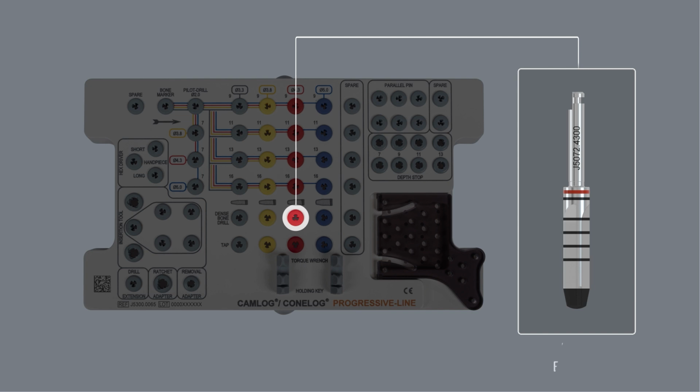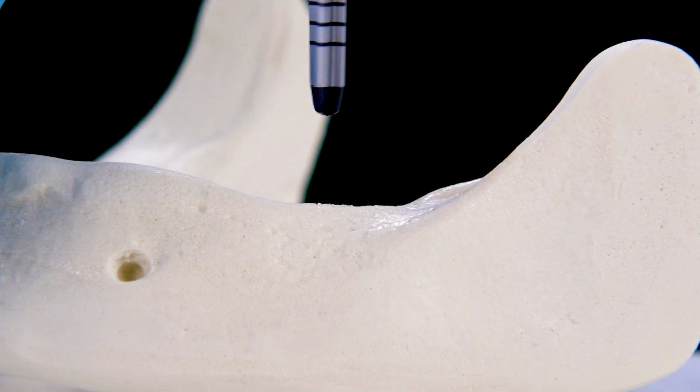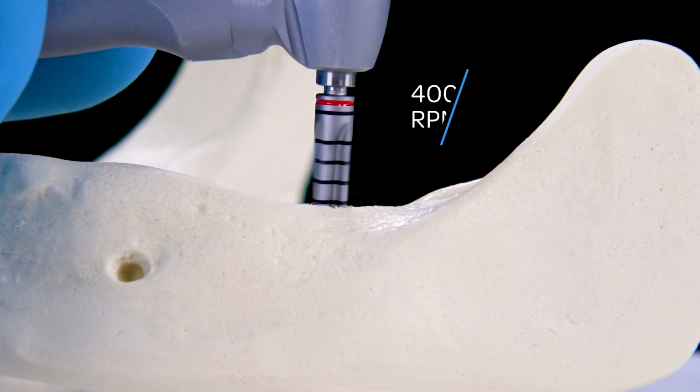For bone qualities D1 and D2, the use of the dense bone drills is required to reduce the torque when inserting the implant. The dense bone drill 2 can be used for a very hard bone.